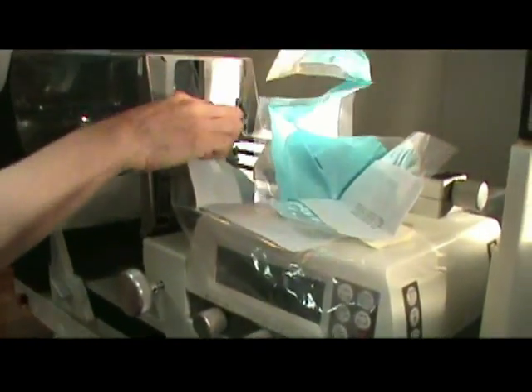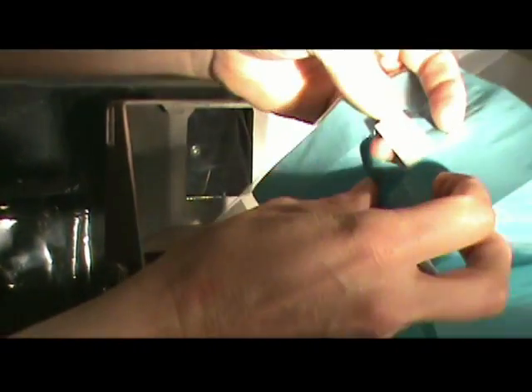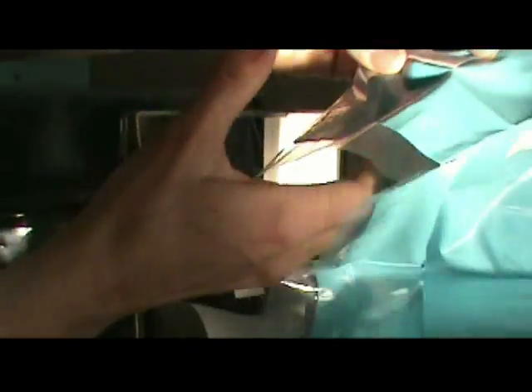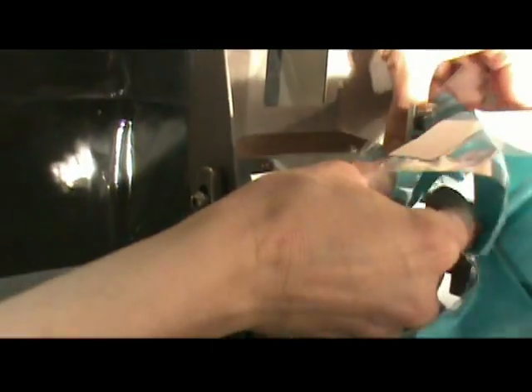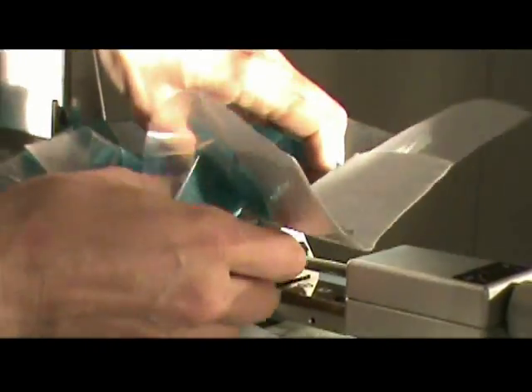Starting right up here at the needle guide itself, there's a little horizontal opening here, and we're just going to put this right over here. The larger opening goes around the large screw area and comes across the back like this.